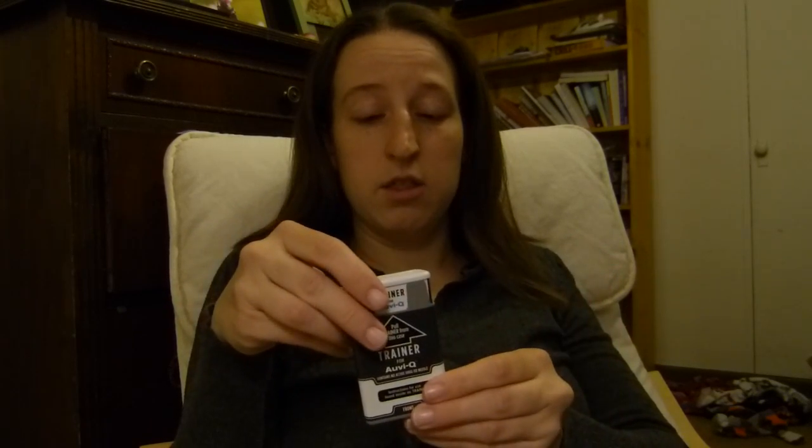So obviously you wouldn't do it in your arm. You would do it in your thigh if you were having an allergic reaction. But how incredibly cool is that? It's like the defibrillators that just talk you through it so that anybody could do it. You could just be like, here, I'm having an allergic reaction. Will you help me? And somebody could very easily do this for you or do it for your child.